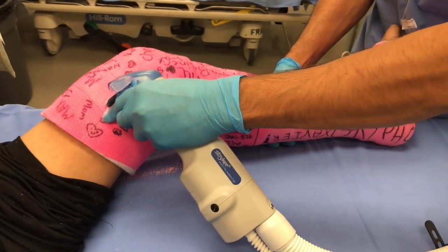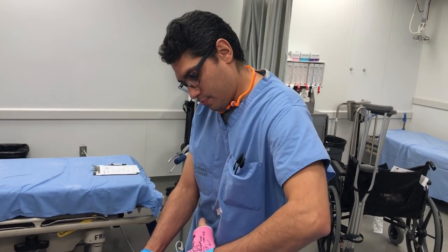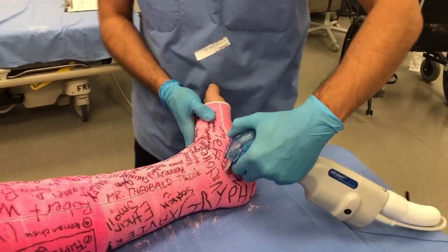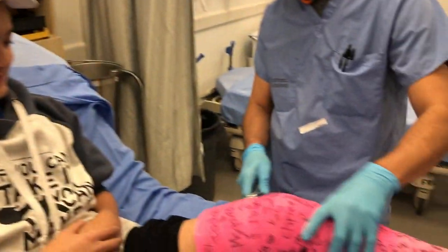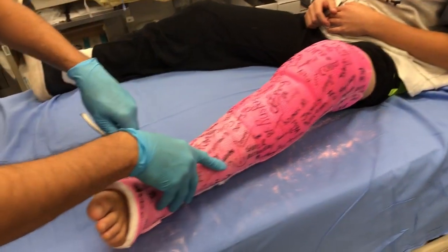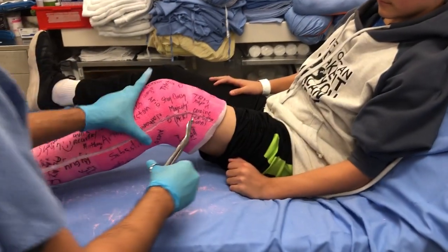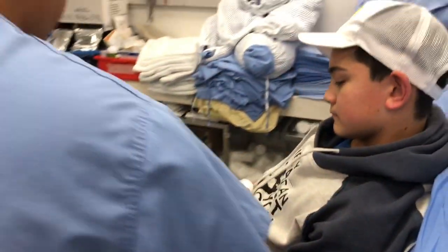How'd that feel, buddy? Did that hurt? No, not at all. Nice. Now we're going to spread that cast like opening nuts. There you are. Now we're going to do the same here. Carlos, I think we want to keep this cast. Oh yeah, he can keep it — look at all the signatures. And now we're going to cut the linen inside. But the most important is I don't cut with this — they don't cut skin, they are safe.